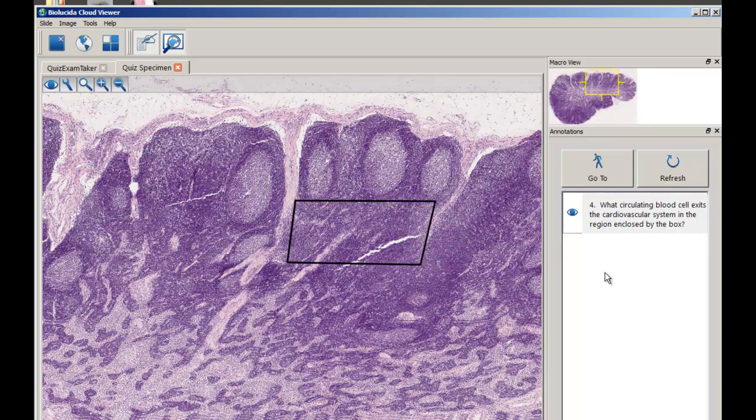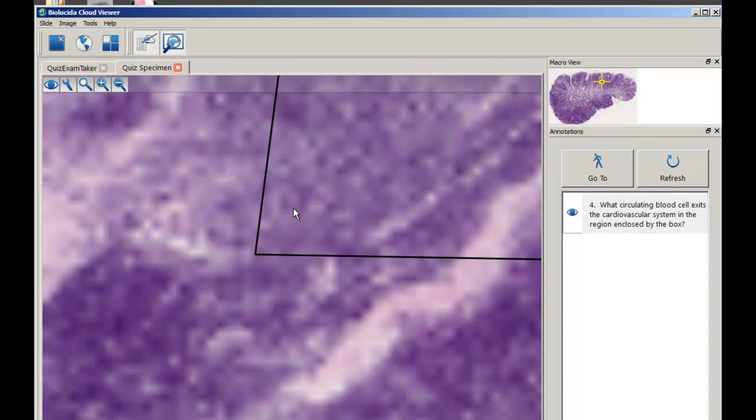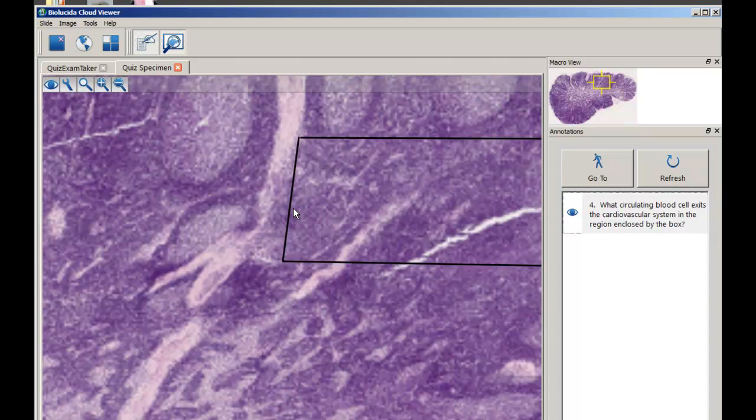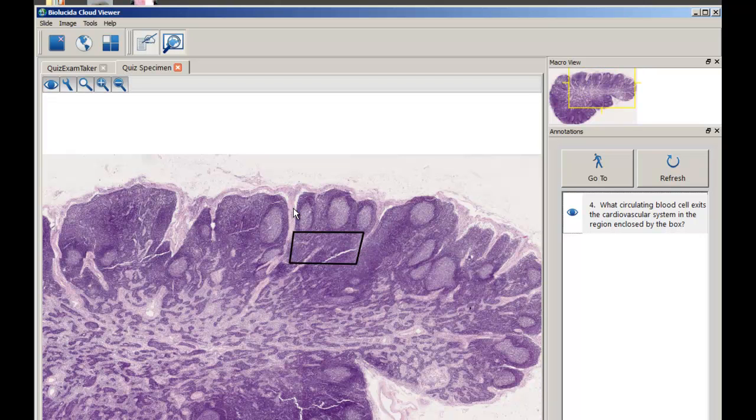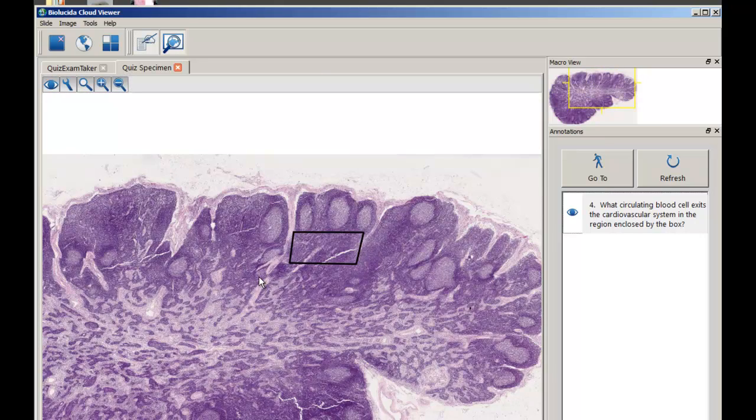Now the other way to zoom is on the PC. You can put Control plus. You see, that's what I'm doing. Keystroke, Control plus or Control minus. And you can zoom that way. And on the Macintosh, it's Command plus, Command minus. And now, let's see, what else here?